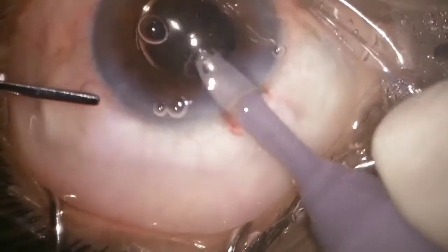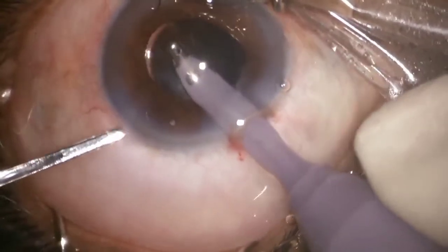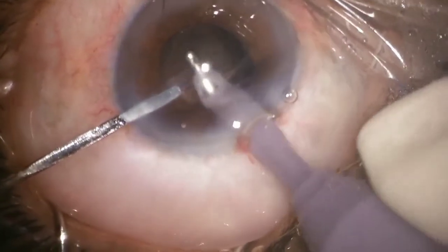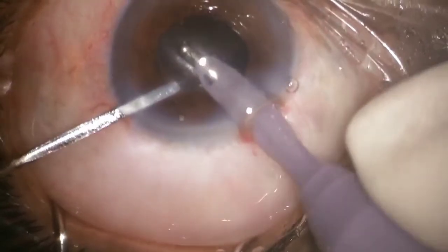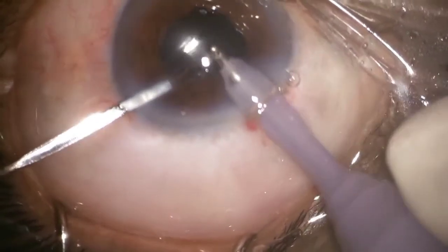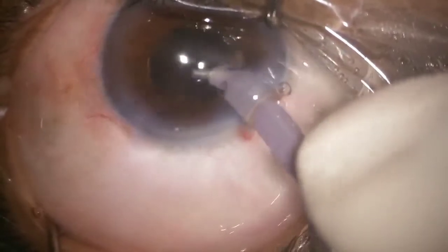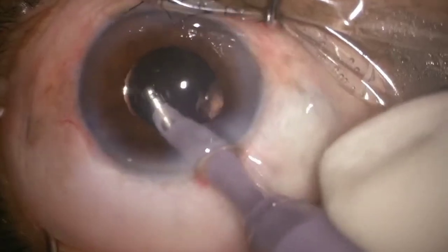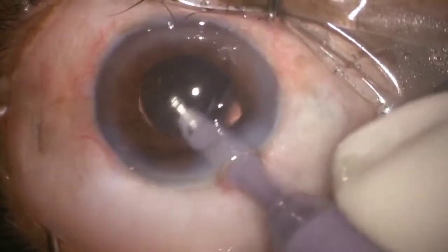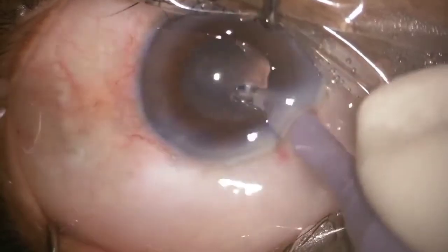As I told earlier, I noticed some cortical matter in the subincisional part. So I took the repositor, and by using the rock and roll technique, I was removing the visco, and then I noticed one cortical splinter was there in the subincisional part, and very slowly I removed it, and there was no further cortex or visco present.